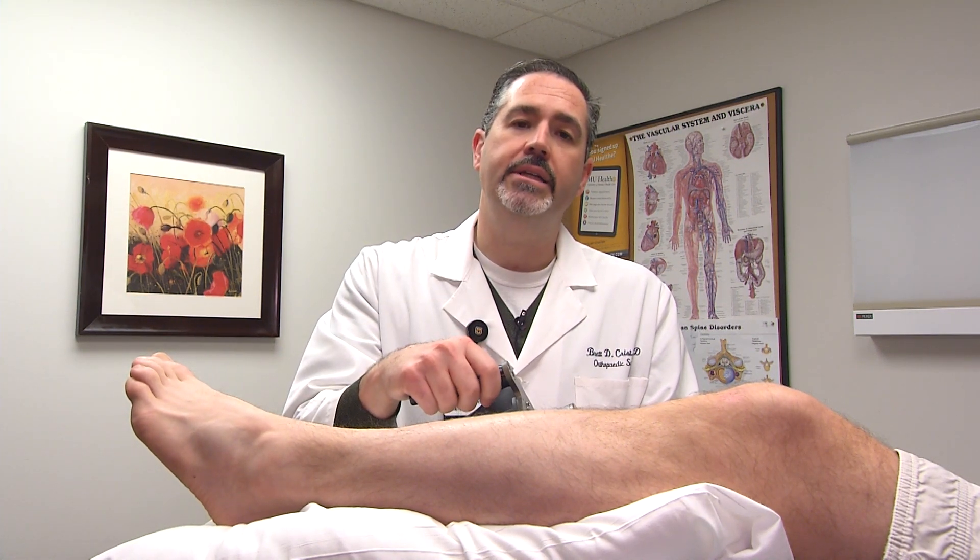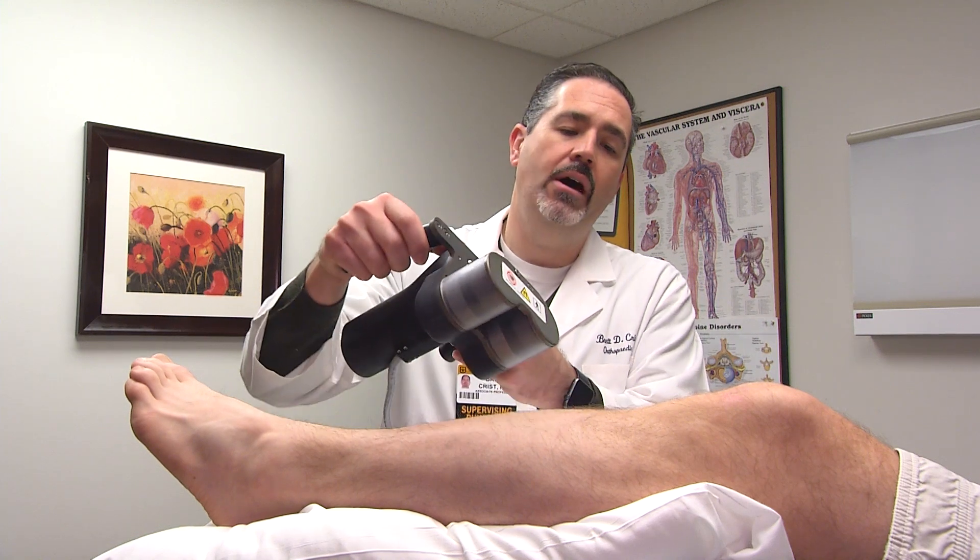We can take them to surgery and place a rod inside their bone that actually moves over time with the use of a device like this. We make the bone cut, we have them come back to clinic, and they start to use this device each day at home.